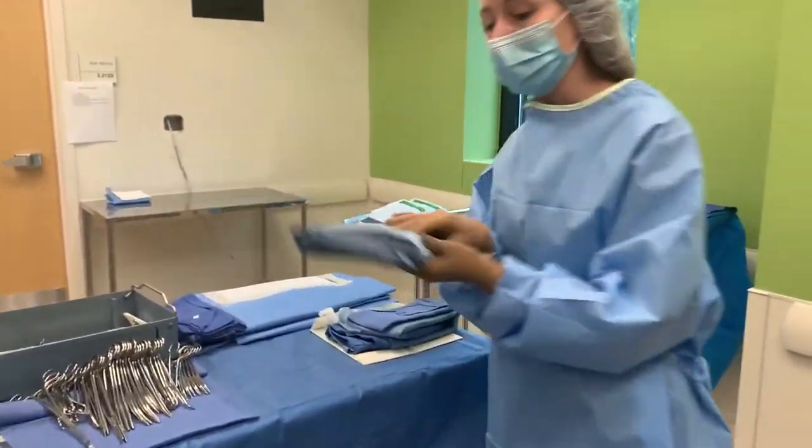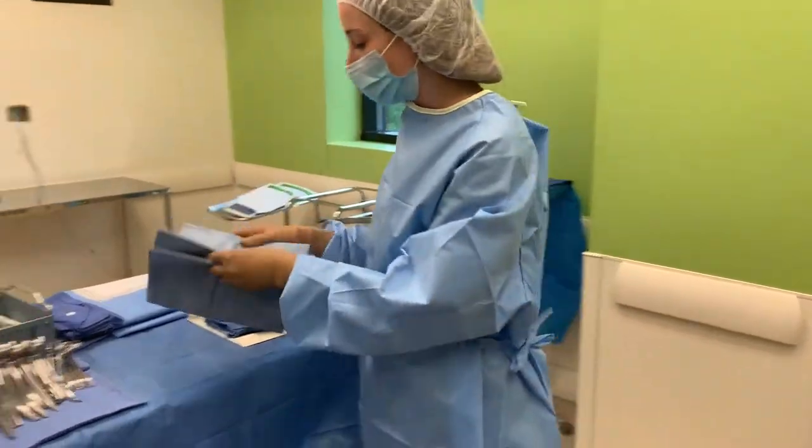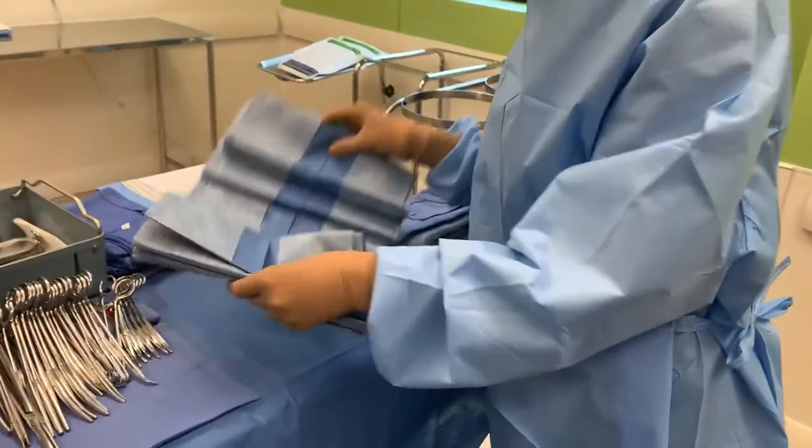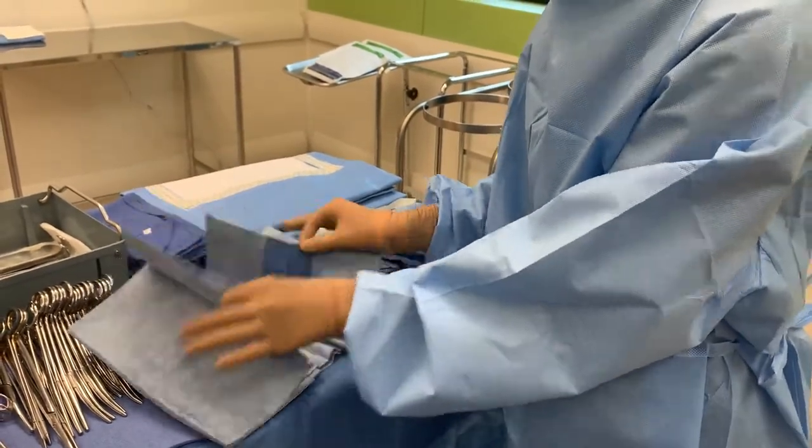What you'll do is get your three-quarter sheet, just like this. You can always stay above your back table, orient yourself to the drape, and open it up to find your two edges.